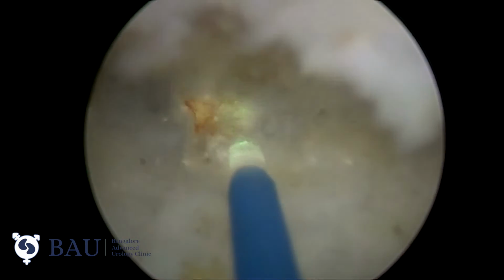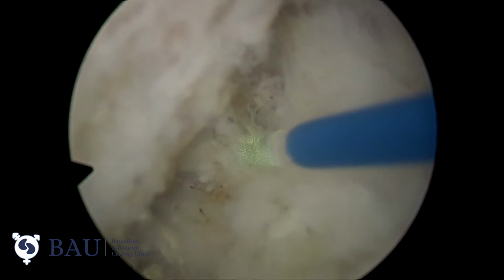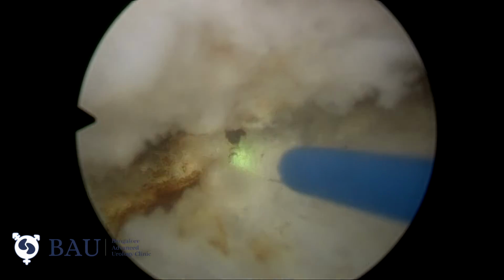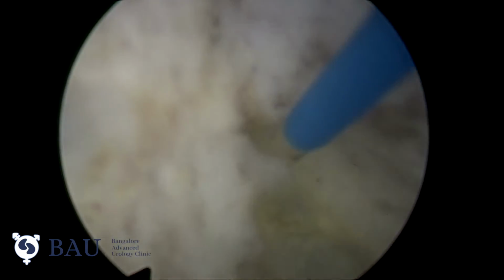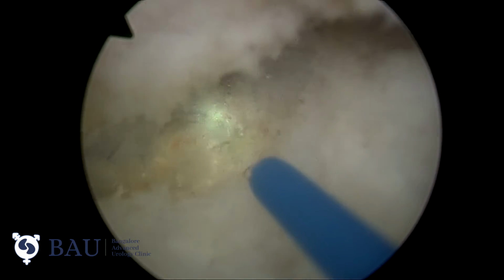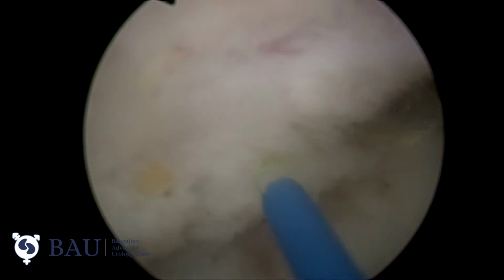Since we are seeing a very good plane, we are proceeding in the posterior aspect. Always have a broader movement. Release the lobe as laterally as possible, and as long as you are getting a good plane, continue in that same plane.